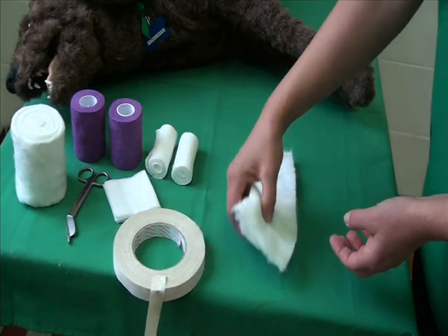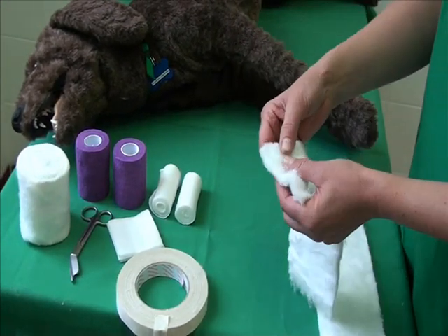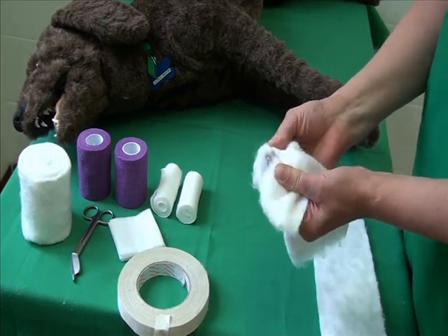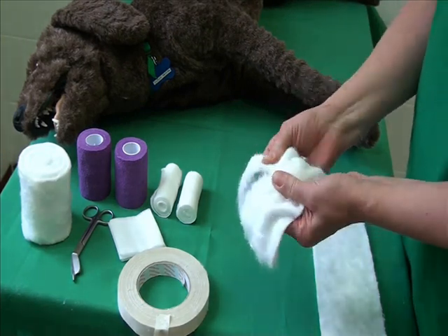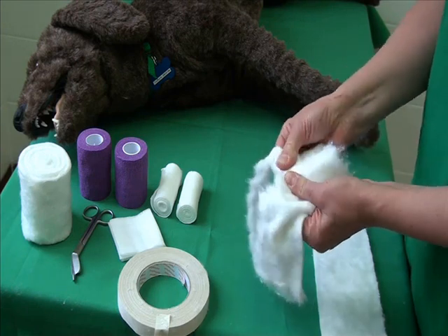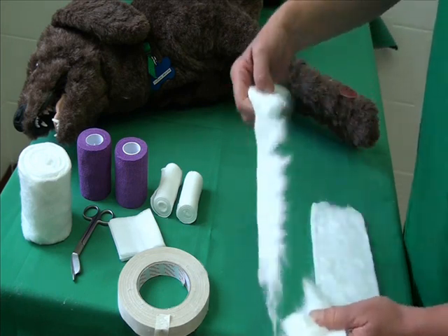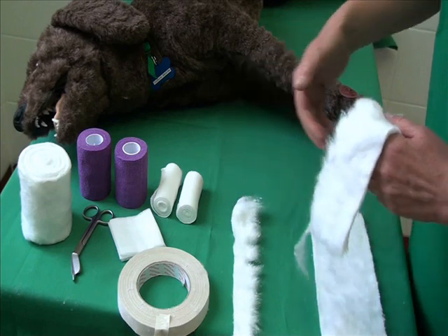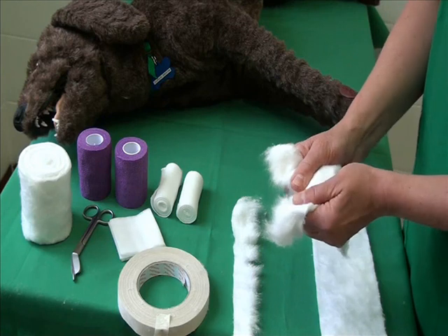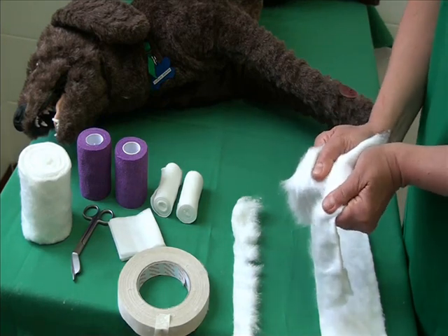Make four cotton wool strips to go between the toes. The strips should be long enough so that they can all be comfortably held in one hand around the dog's paw. Four strips are needed.